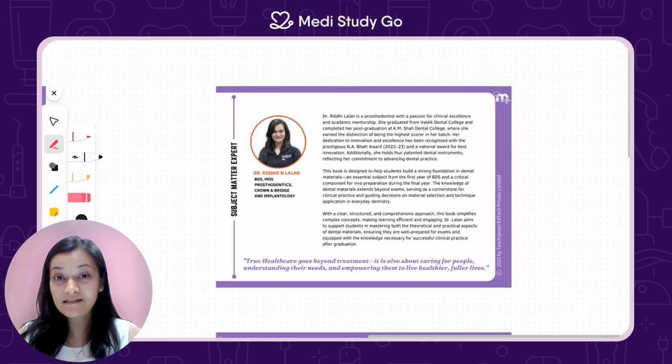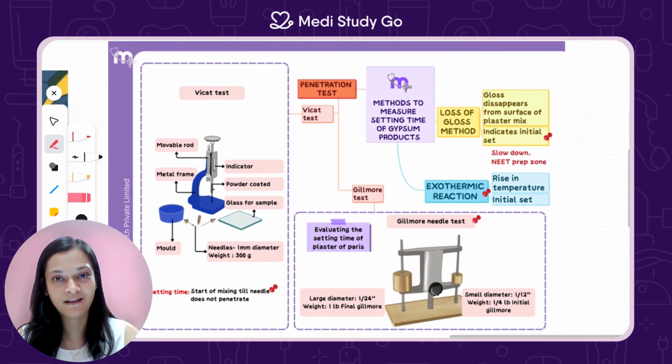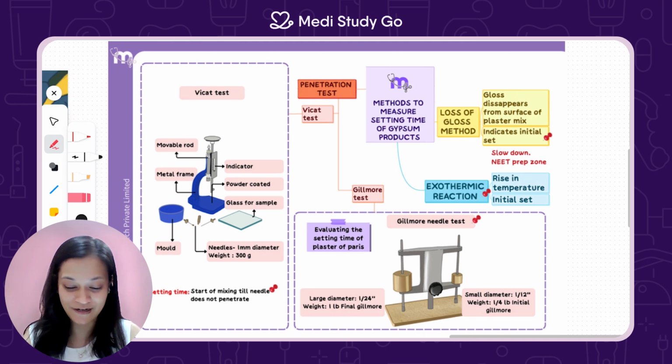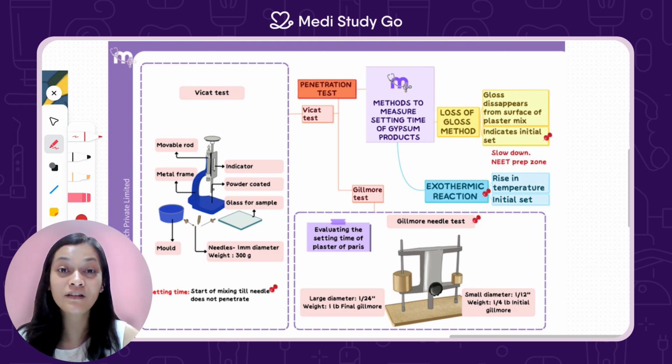If you are a dental student, then you have to know your gypsum product very well. You have to make gypsum your best friend. So let's discuss about how exactly can we know if the gypsum has set or not.